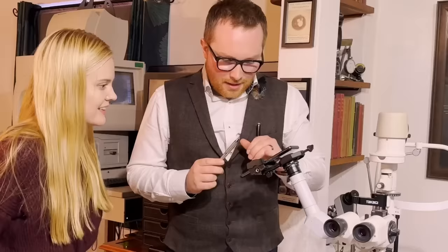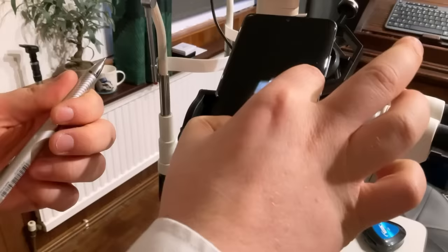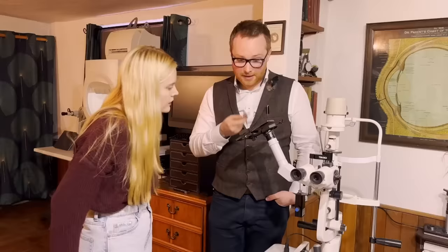So essentially this is just a photograph of the front of your eye. This was you looking over to the left. So it's just the white of your eye here. We'll zoom in on that. And you can sort of see that this brown streaky region, it's just little bits of pigment on the white of your eye. So perfectly harmless. And so it's absolutely fine. Now that we've got an image, we can just take another one.